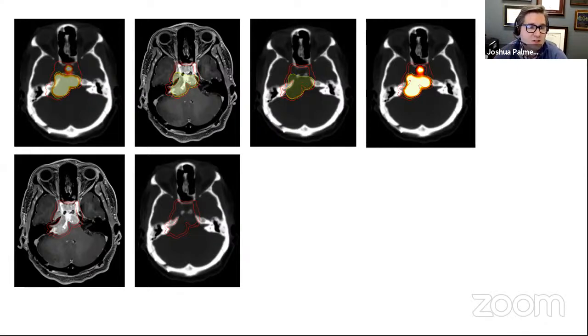I've actually seen that the tumor is better seen in some of our cases on the DOTATATE in the head and neck area, where the MRI, or at least the neuroradiologist, didn't realize the tumor went down that low, because it falls into an area where, with the fat saturation, it just looks like normal tissue. And so the gallium DOTATATE outlines it quite nicely in the skull base.